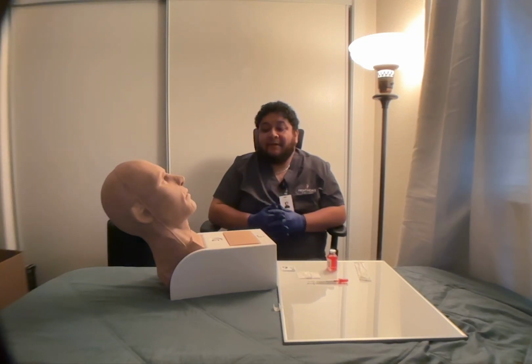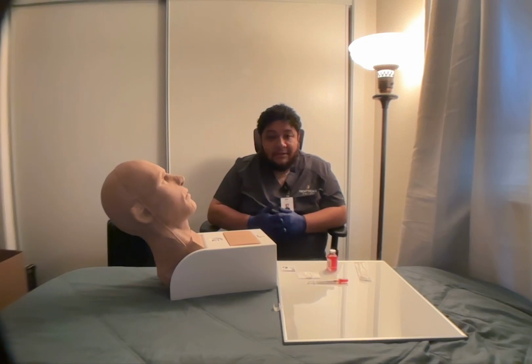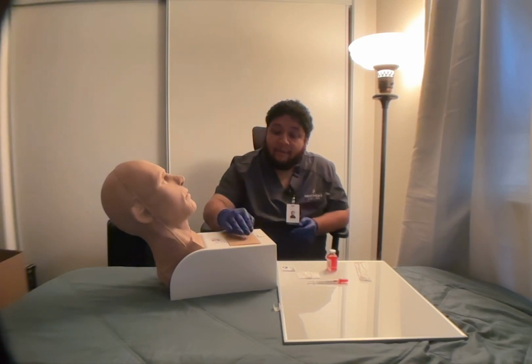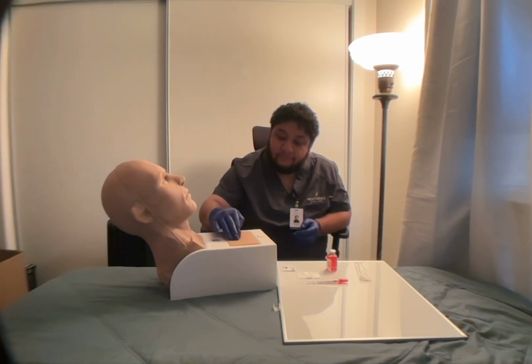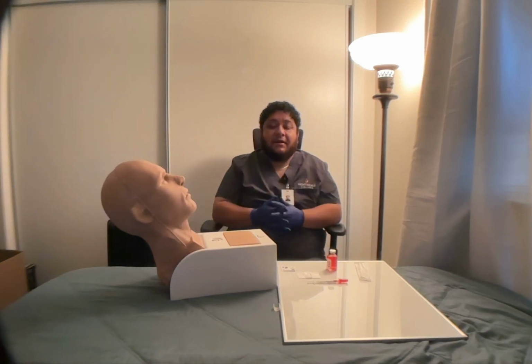I'm going to go ahead and inspect for any lesions, discoloration and tenderness, and I'm going to go ahead and palpate. All right, area seems good.